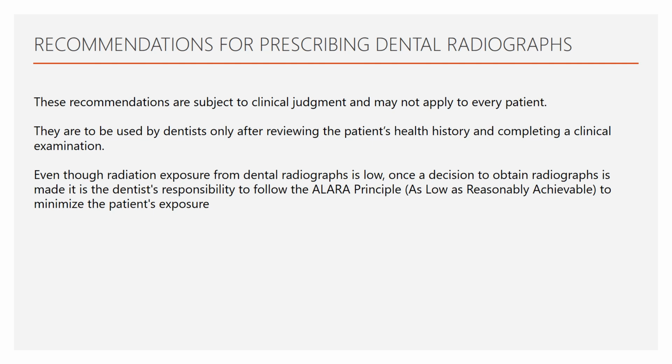So again I am stressing, whenever a radiograph is required you have to use it, but you have to use it wisely. If there is a need, only then should we use it. Just because there is caries, there is no need to take a radiograph. If you are not able to assess the depth of the cavity or the caries, and definitely proximal lesions which sometimes you won't be able to identify with the help of a probe, then in that case you have to go ahead with a radiograph.